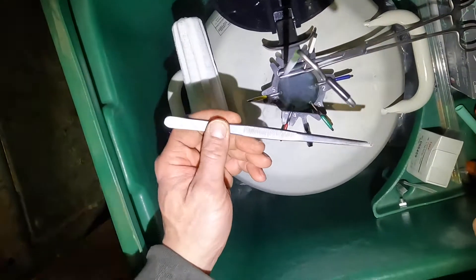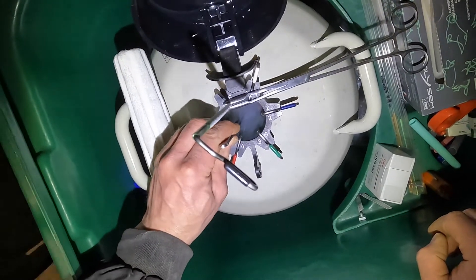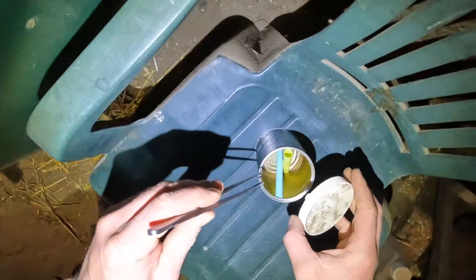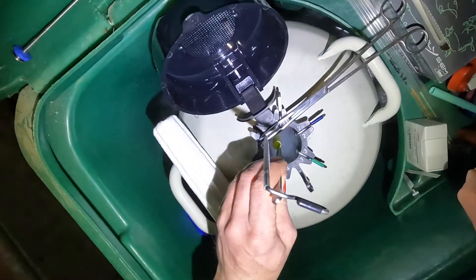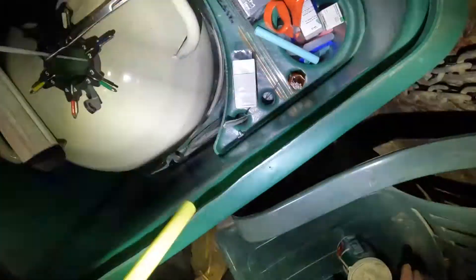I then use another component in my kit: some long reach tweezers, so I can get well down in the neck of the flask with my delivered semen. I'll come to my shipper, remove its bung or plug, replace it, and put my delivered straws in their pot into my flask.